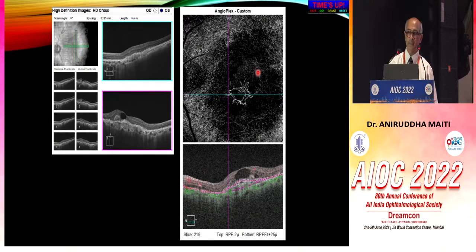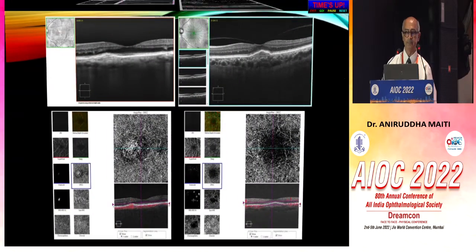On the other hand, sometimes you have a situation like this where you have cystoid spaces, not outer retinal tubulations, but you want to know, is this an endpoint for this patient? And here you can see what is known as a prune tree appearance, where the neovascularization has regressed, and therefore you can say that this is an endpoint even though there are cystoid spaces and no outer retinal tubulations which would ordinarily be used to stop treatment.